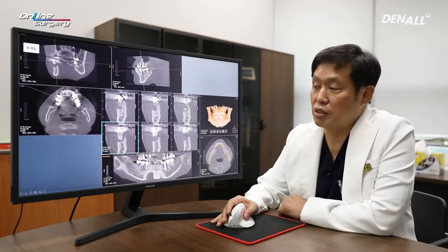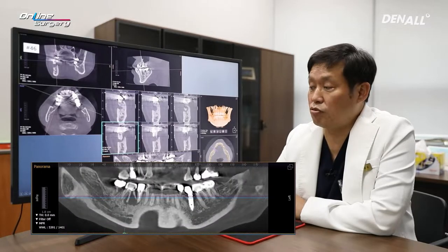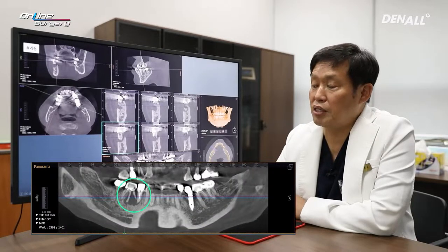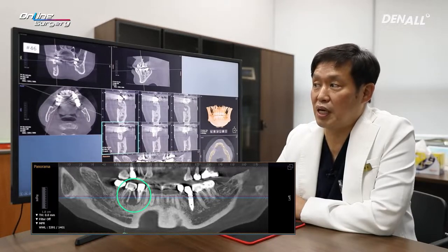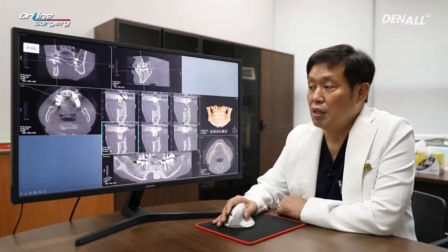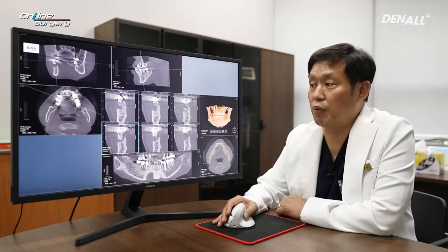As mentioned, because of root fracture in number 46, the periapical lesion was exacerbated and the buccal wall was entirely destroyed. Socket preservation was planned.